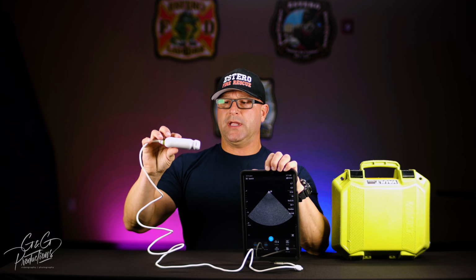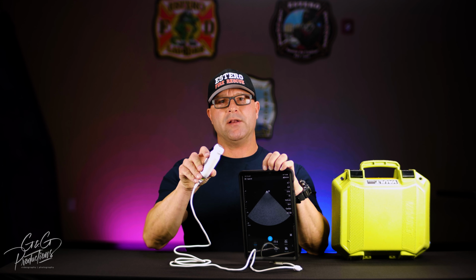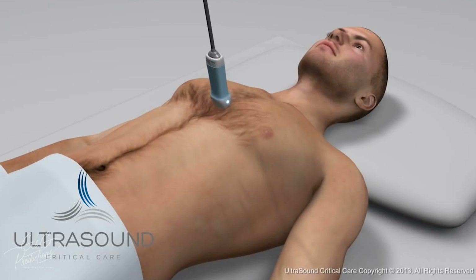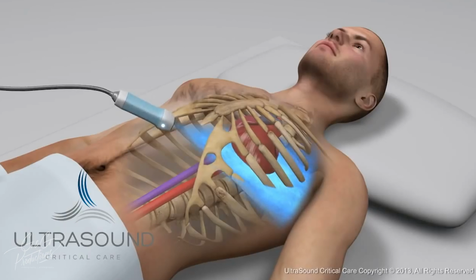And your transducer is not going to be at a 90 degree angle to the patient, but it's going to be flat, like beyond a 45, and you're going to go under the xiphoid. Point the probe marker towards the patient's left side at the 3 o'clock position, and point the probe itself slightly to the patient's left shoulder. The probe should not be at a 90 degree angle, but it should be down closest to the patient's abdomen to get that best image that you want, right?